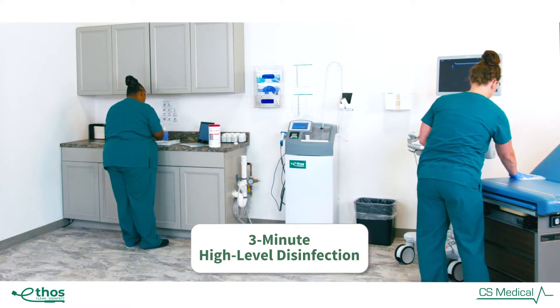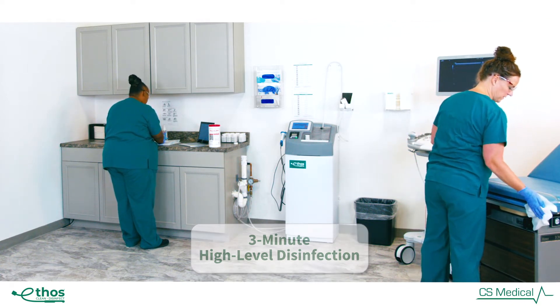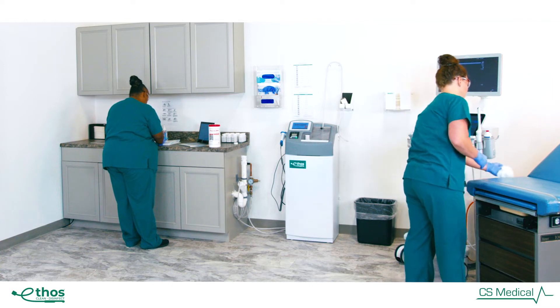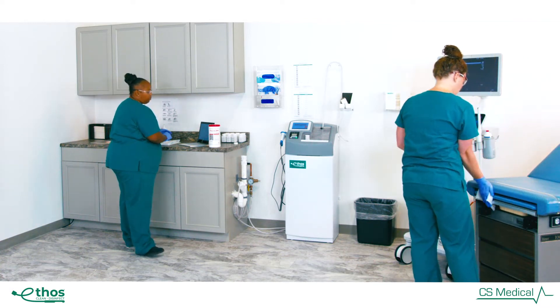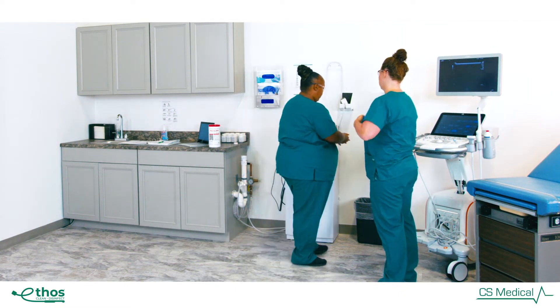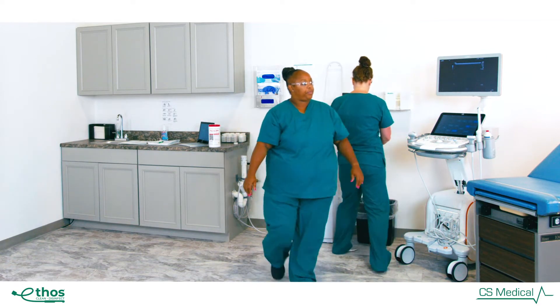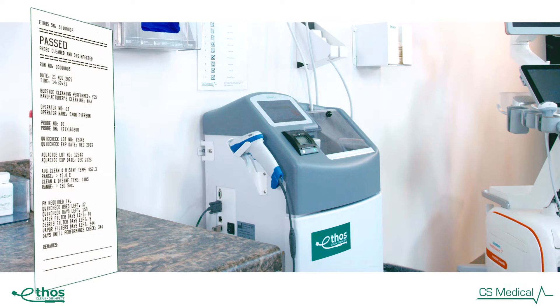Disinfectant efficacy is confirmed and recorded for each reprocessing cycle. After the 3-minute high-level disinfection cycle is completed, the probe is then given a final rinse in 5-nanometer filtered water to remove any residual disinfectant and prevent re-exposure to waterborne bacteria prior to cycle completion.